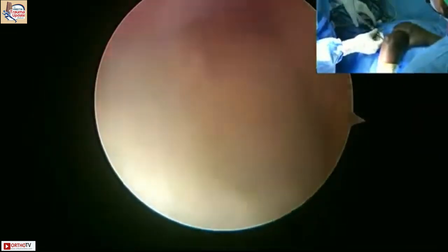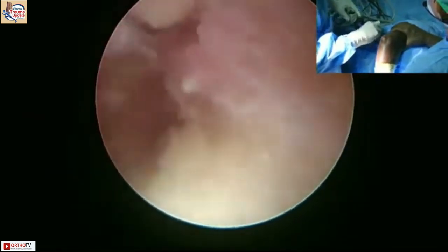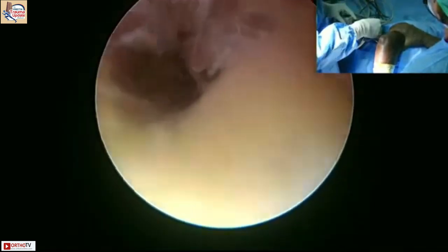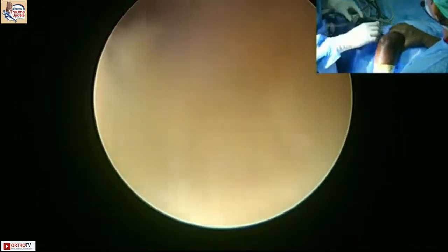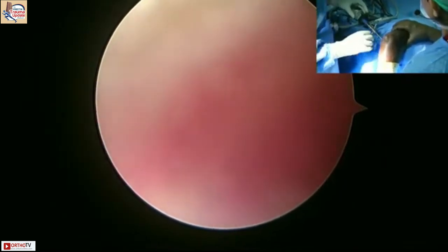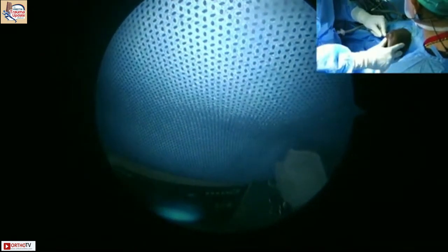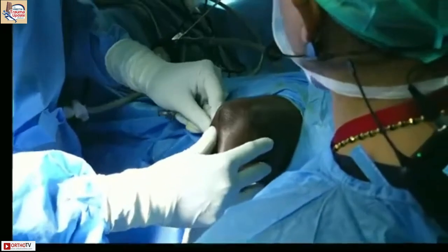Any questions from the audience can be directed to us. Just gravity assisted saline, or do you use any pump for this elbow and wrist? Just normal saline, without a pump. Okay. Another thing you can use is a syringe with some fluid in it, and you can use your other portal, the cannula, to allow pressure if you want pressure.